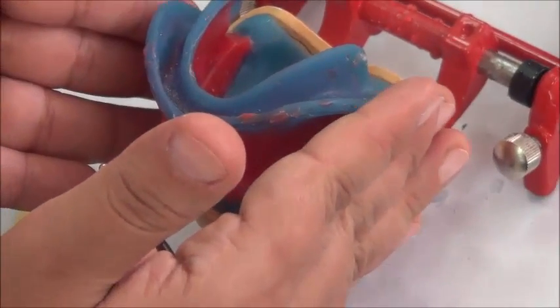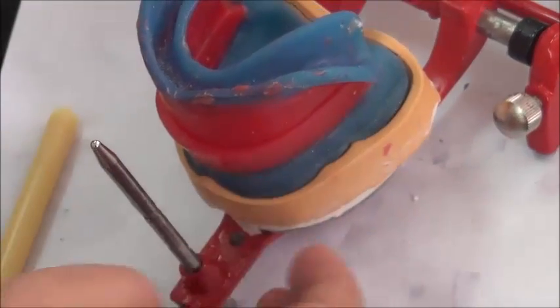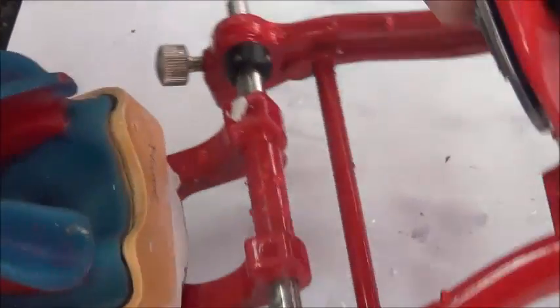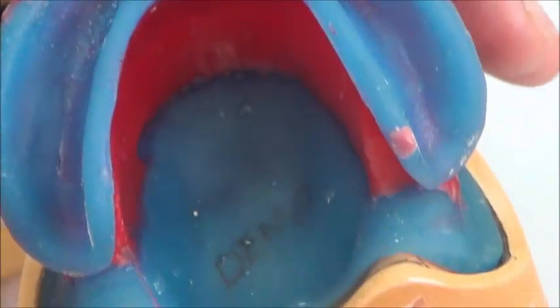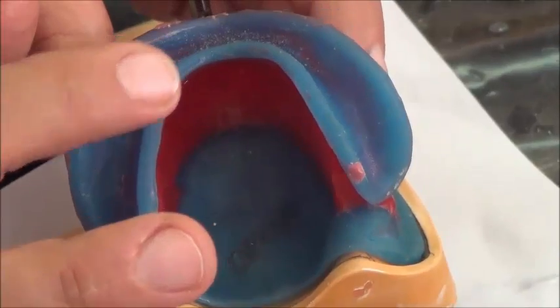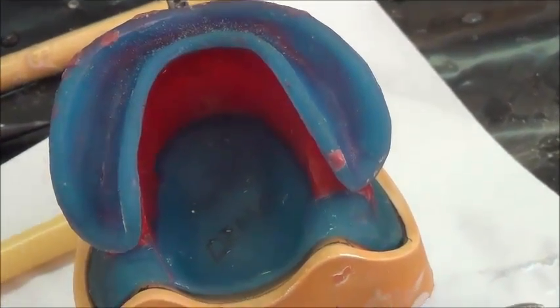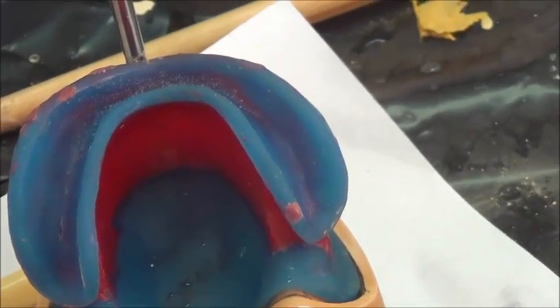So once it's centered, I'm using my vision here, vertical vision. I'm also looking at it from posteriorly. If you look at it from the posterior, you find that the ridge is centered over this. So it's centered and a bit more anterior to make the overjet exactly 2 to 4 millimeters. And now this is ready to be mounted.